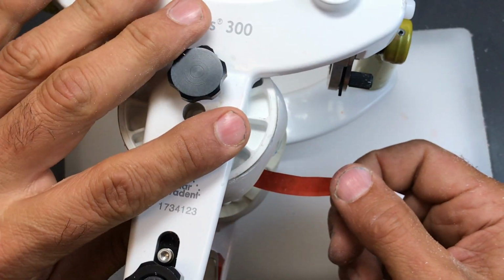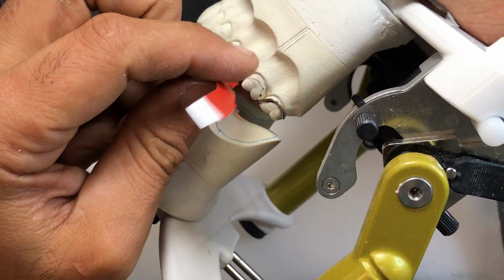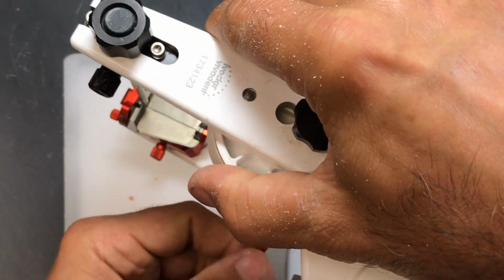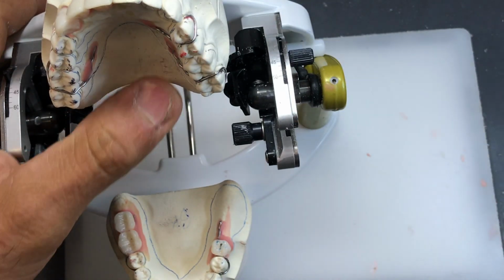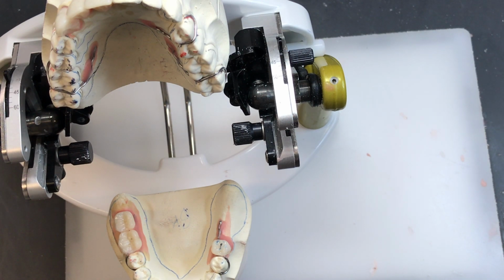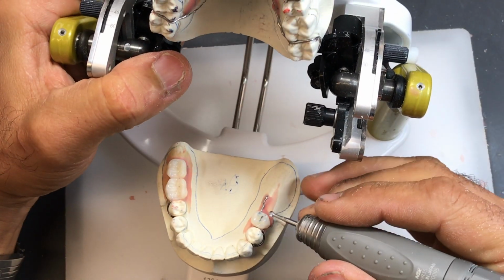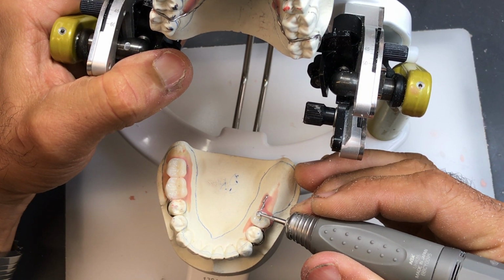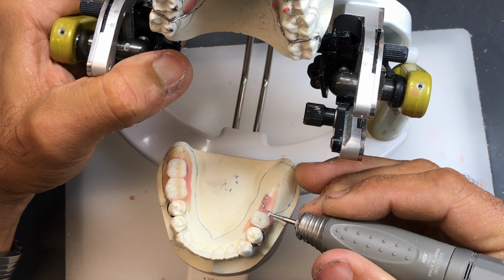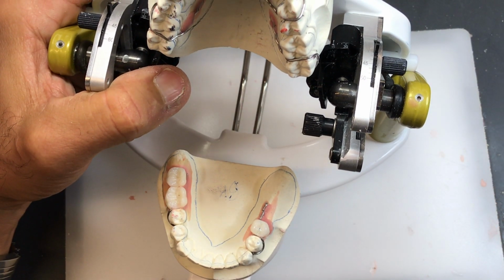All right, so gently, we're going to tap. And there you can see a little imprint of the articulating paper where it needs to be reduced. And hopefully we've elevated the tooth just enough to reduce a little bit and provide a better intercuspation, or maximizing the centric contact without destroying all of the anatomy.